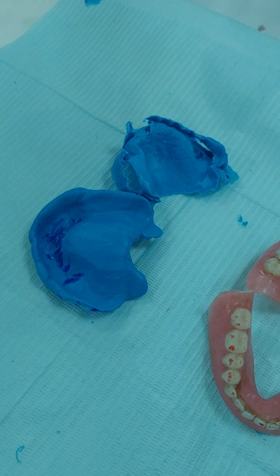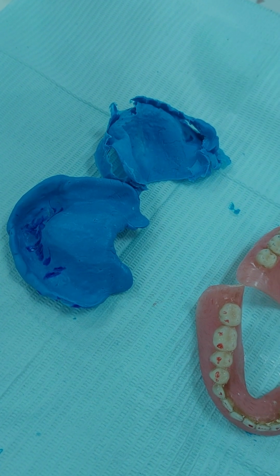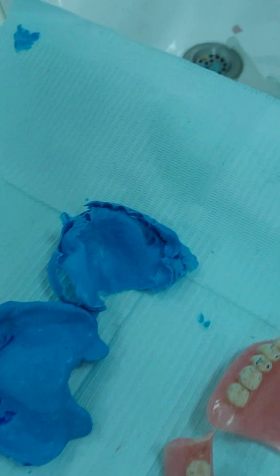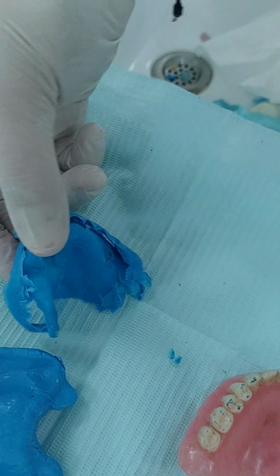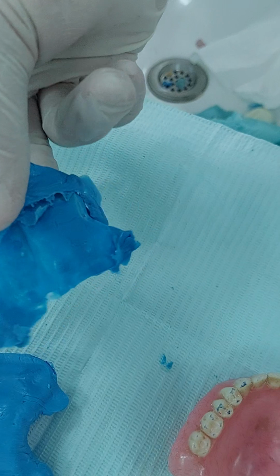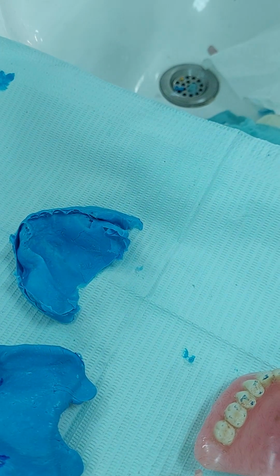So the first time it was very thick. The denture, the rubber material, meant that the denture was not fitting. We adjusted high spots and it became thinner. If you can just move it please with your hand. See how thin it is, and there is even a shadow in between. And we also found some heavy spots on the fitting surface, so we adjusted them.